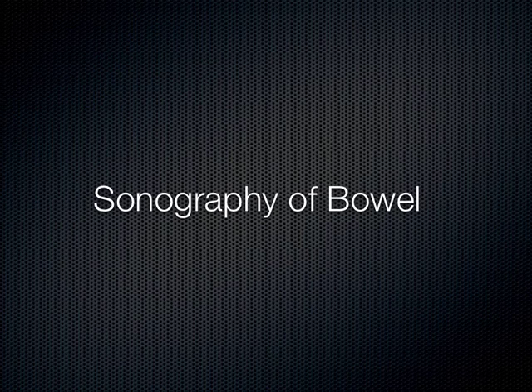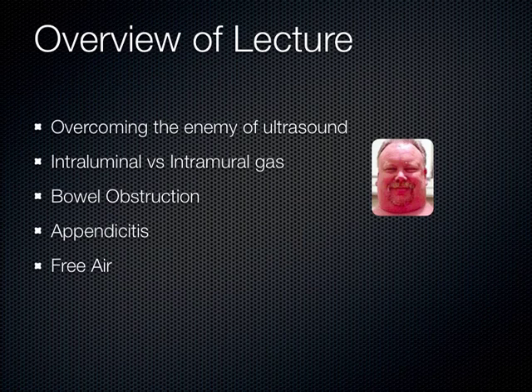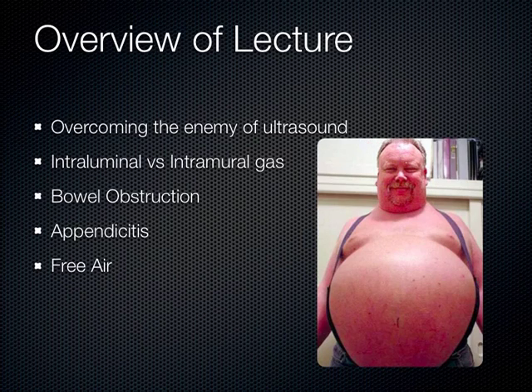Air, bowel gas, generally speaking. And so that's the problem. We have the enemy of ultrasound being the bowel gas. And in some patients, it's pretty significant how much bowel gas they can have, right? So that's why we have to somehow overcome that enemy.